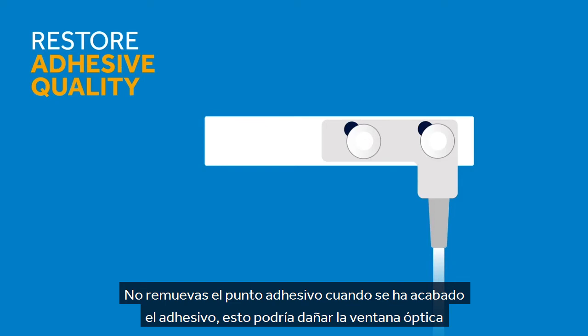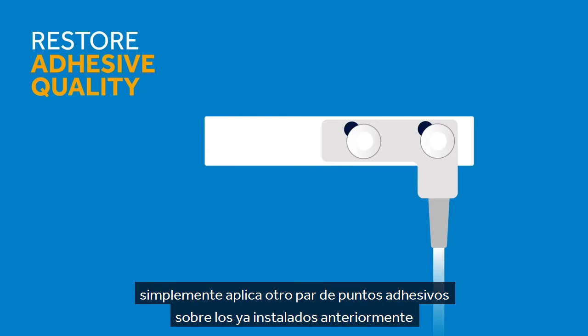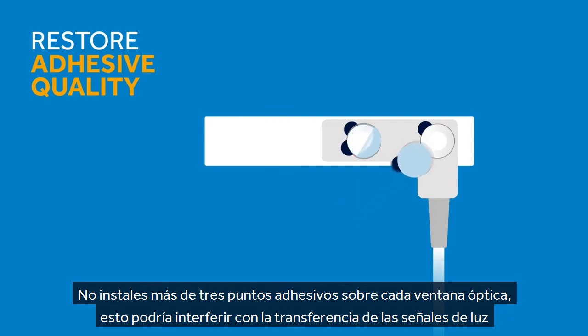Do not remove the sticky dots when the adhesive goes, as this will damage the optical windows. Simply apply another pair of sticky dots over the top of the previous ones. Do not have more than 3 sticky dots on each window, as this will interfere with the transfer of light.